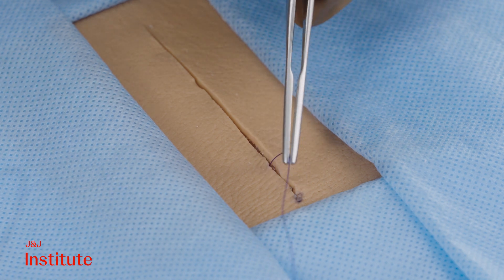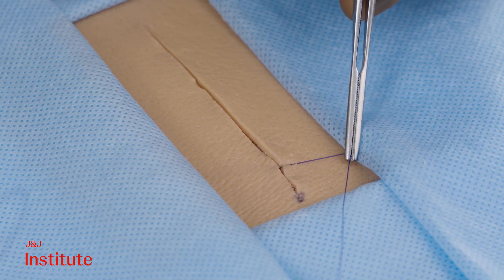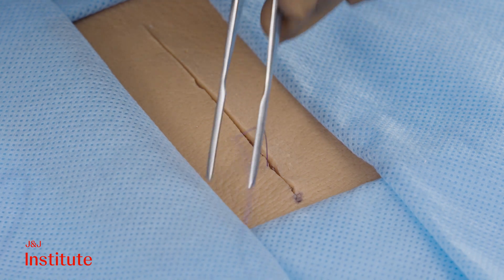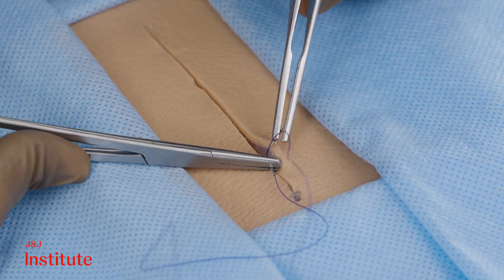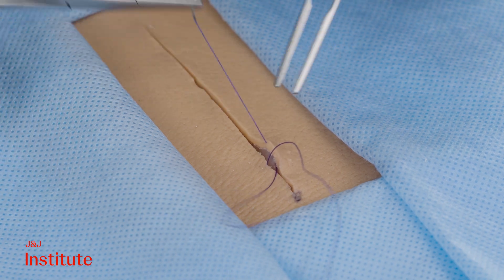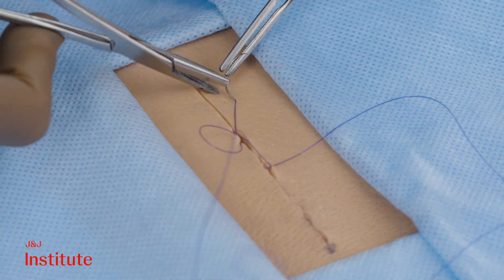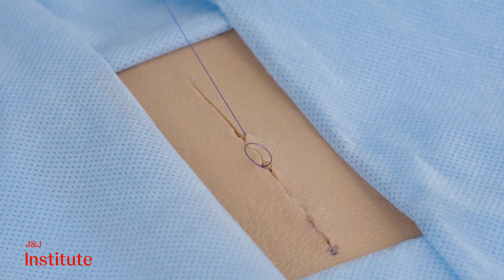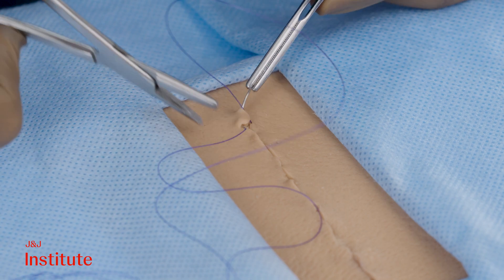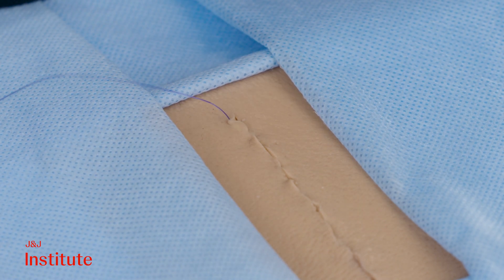The point of entry on the opposite side should be directly opposite the earlier point of exit. This helps achieve a snug closure. Symmetrical small bites ensure neat apposition of the skin edges, resulting in an invisible suture and a cosmetically pleasing outcome. A zigzag pattern may indicate larger asymmetrical bites taken too far along the incision, leading to gaps upon tightening.